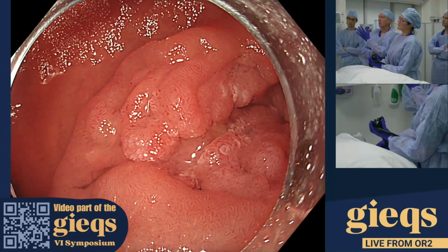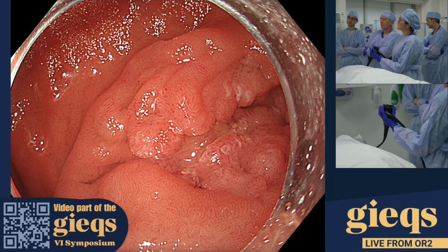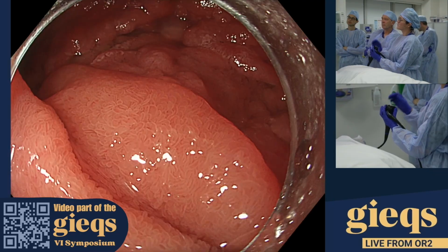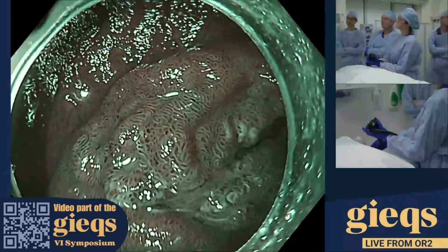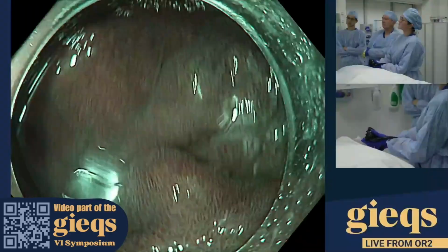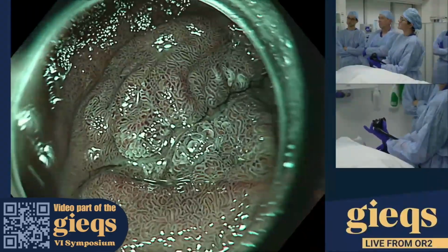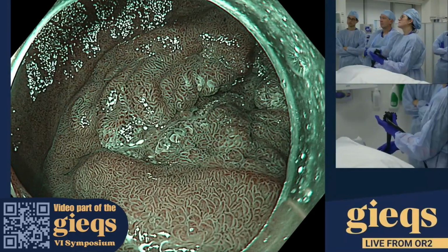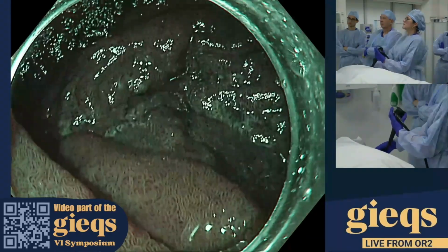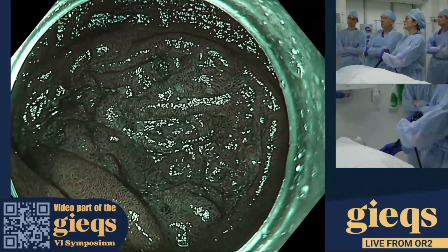So that's the first. So I think the key message there is, and let's get Leon to comment, because I know you're doing this a lot. An overview is very useful, right? You agree, Leon? Yeah. I totally agree that an overview is essential, also for us to interpret whether we can remove it. But what I often see, and what should be stressed as well, is that what Rose is doing, she is going gently over the lesion.